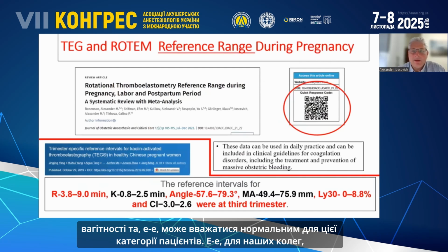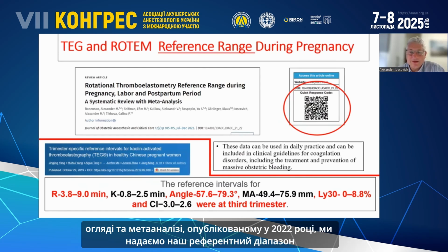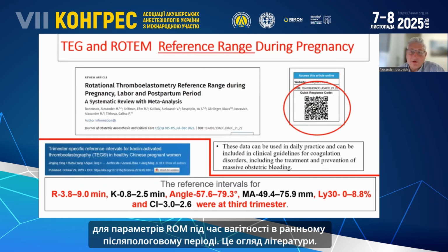For our colleagues that use ROTEM, in this systematic review and meta-analysis, which was published in 2022, we provide our reference range for ROTEM parameters during pregnancy and in the early postpartum period.